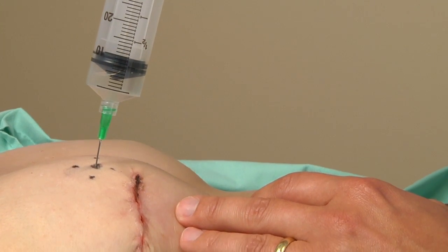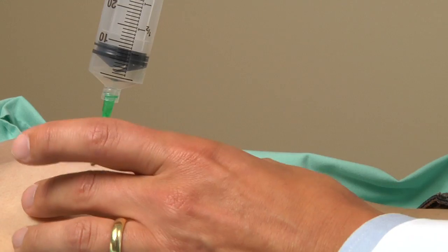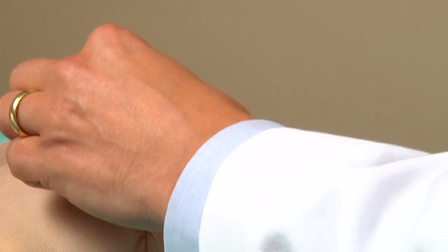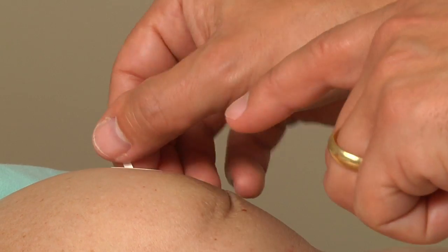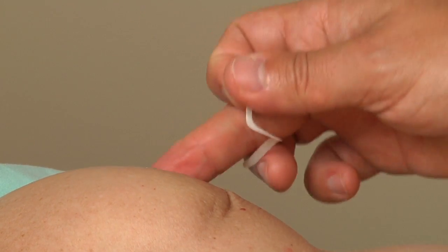That's starting to get a little bit firmer — 55 cc would be fine. The syringe is then removed. Sometimes there will be a little bit of blood, and usually we dress this with a small dressing to avoid any staining on the clothes. After each filling the volume is recorded, not only to determine the final fill volume but also as a guide to subsequent fillings to see how well that volume was tolerated.